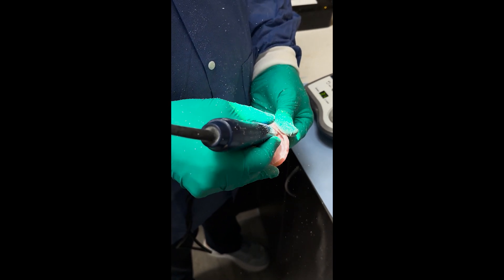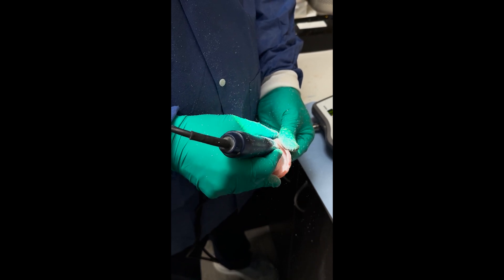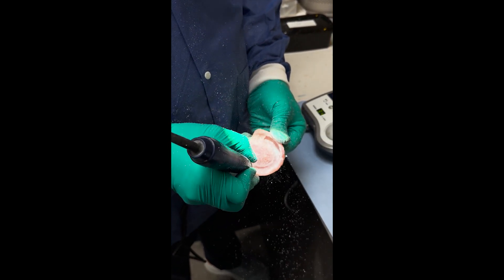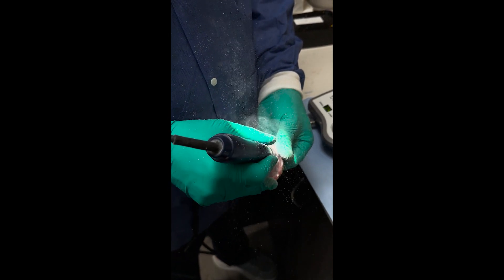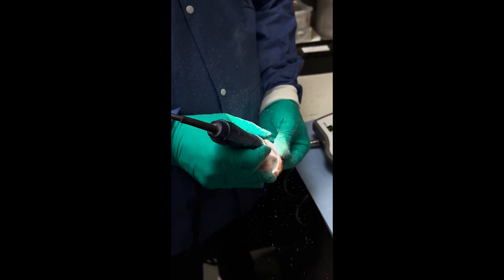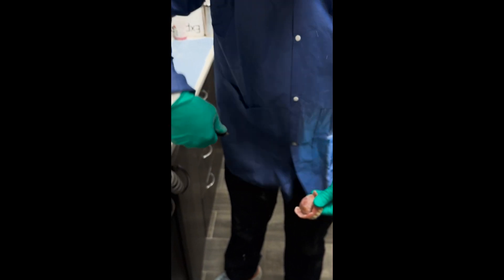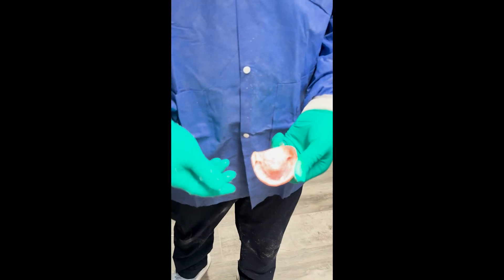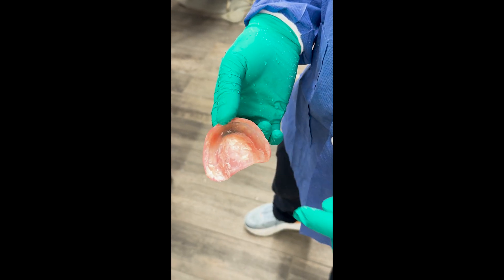We don't need to take the palate out because this is just temporary. We're actually going to take the final impression today — it's a fixed restoration. I'm going to take the impression right in this existing denture. Because I have my own lab here, Shacken First Lab, they'll pour this up while the patient waits, saving me a couple of visits. You can do this in your own office if you get the analog from us — pour it up yourself with die stone, then mount it on the articulator or send it to us, whatever you prefer.